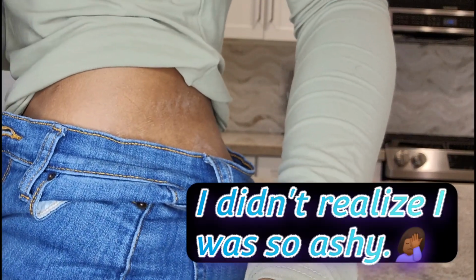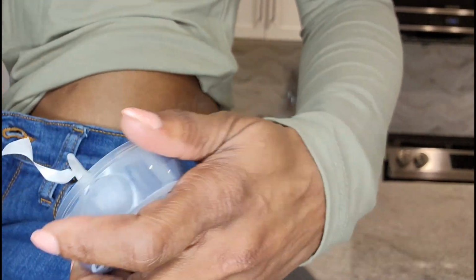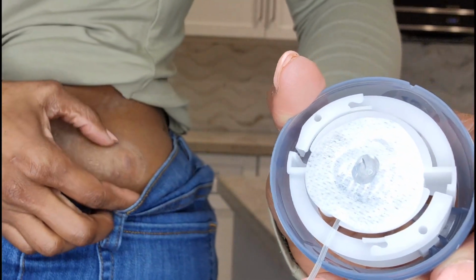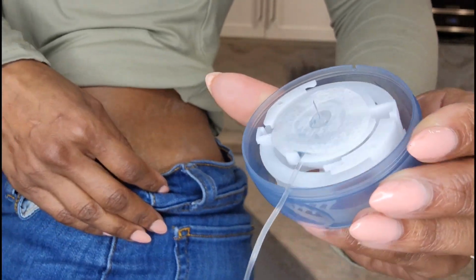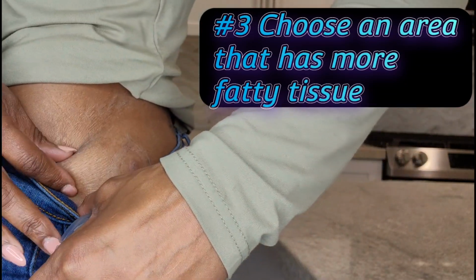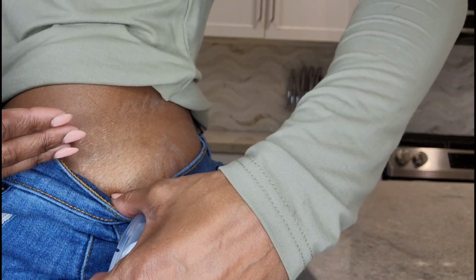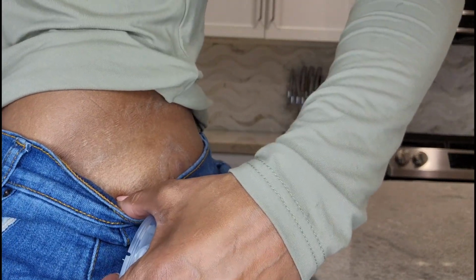So now it is time to reinsert the new set. So we're just gonna peel this little paper off here. You guys will see how this little tool works. Now, I am doing it on the same side, but I'm not gonna do it in the same exact spot. You can see there's some scar tissue right there, so we kind of have to move it around. But this is the third most important thing. Try to find a fatty area, more of a fatty area. The thinner areas, sometimes the cannula bends easily, and then you get occlusion alerts because the insulin is not flowing through properly, and then your sugar ends up being 400. Don't ask me how I know.